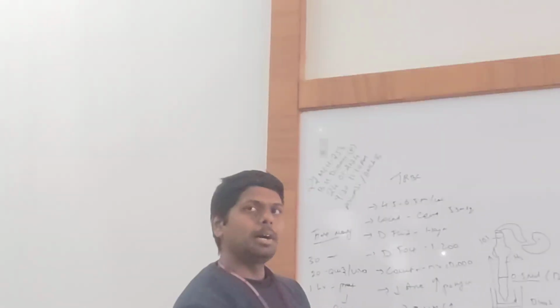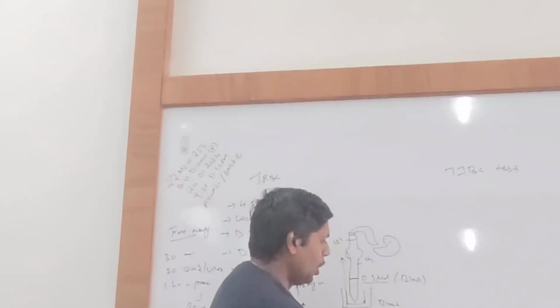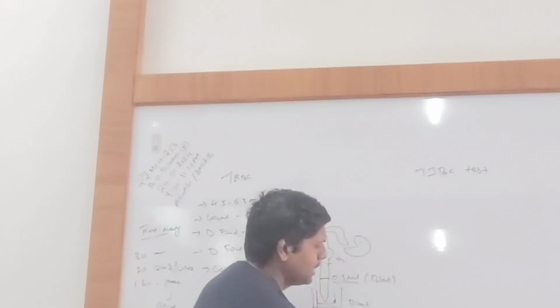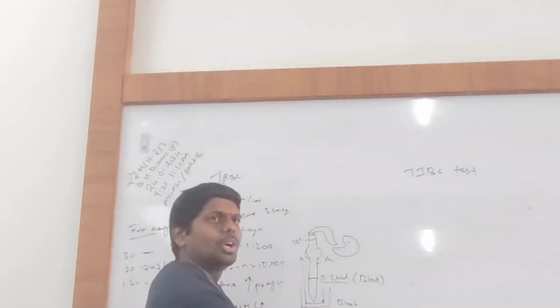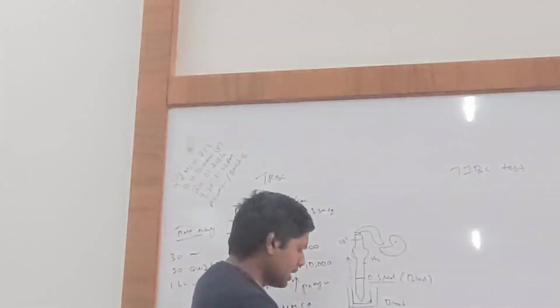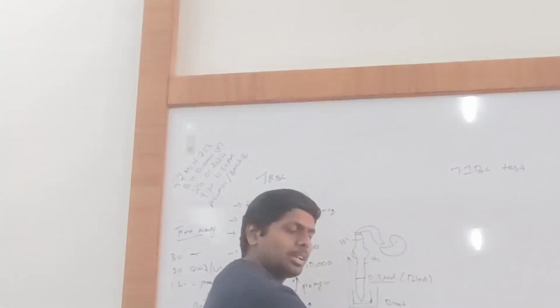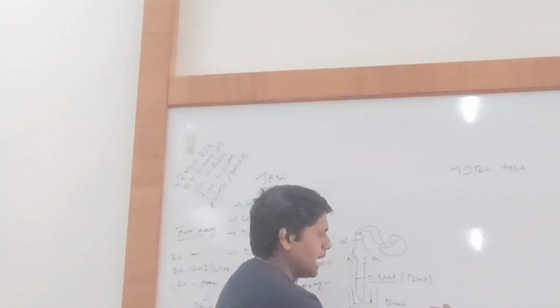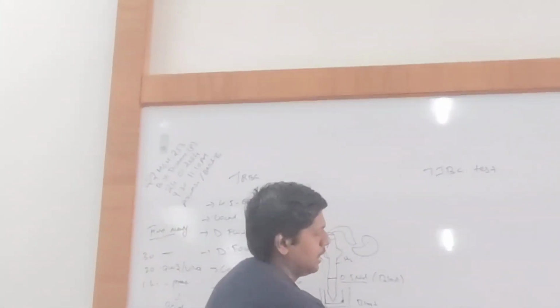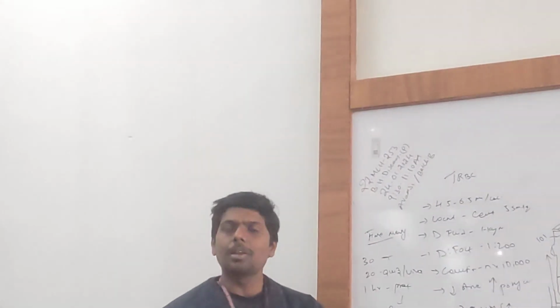And what is the method of calculation? So you will plot 4 into 4 grid, 4 into 5 tables, right? So you will plot 4 into 4 tables. Okay. Then you will start whatever counted under the microscope. You will write the numbers here. Okay. The count, sum of all, that will be your n value. If it is 280, sum of all is 280 into 10,000, and that will be the RBC count in million. Okay. This is how you will perform the test.